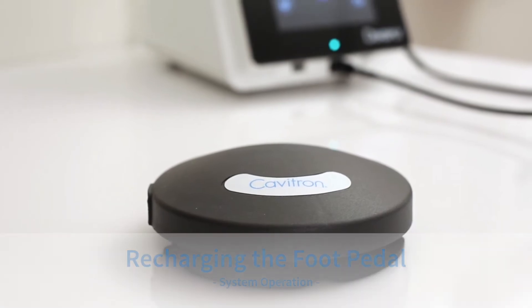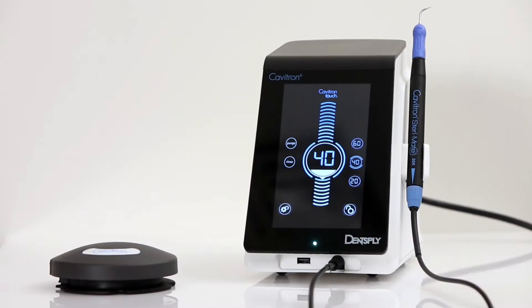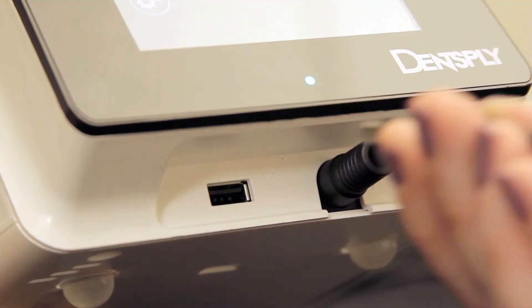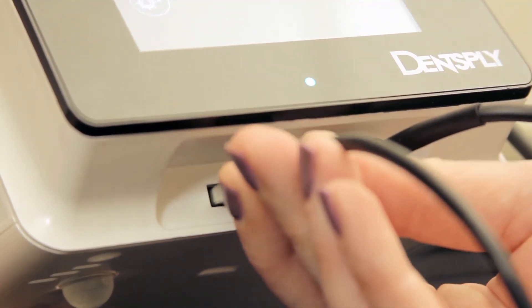Recharging the tap-on foot pedal. With the unit powered on, plug the auxiliary foot pedal cable into the foot pedal and the USB port on the front of the unit.